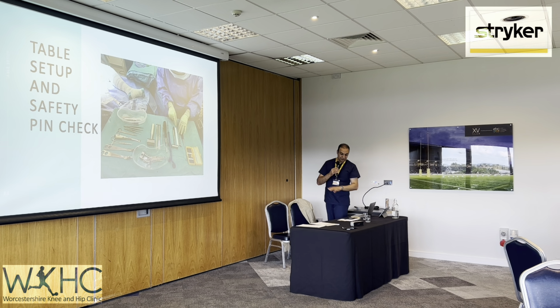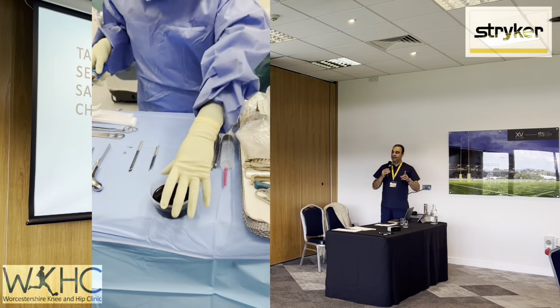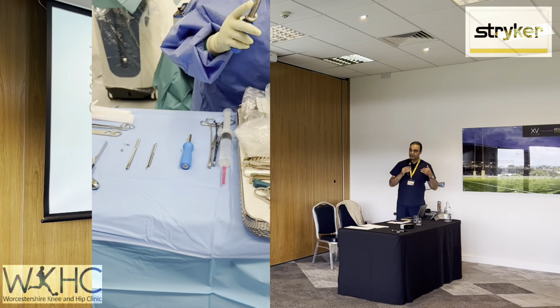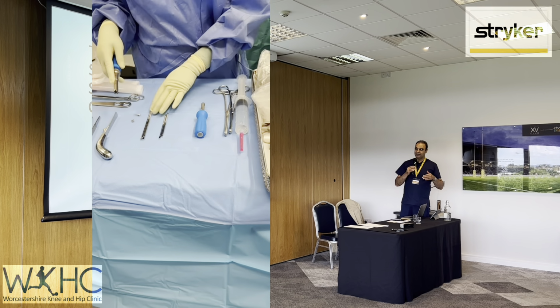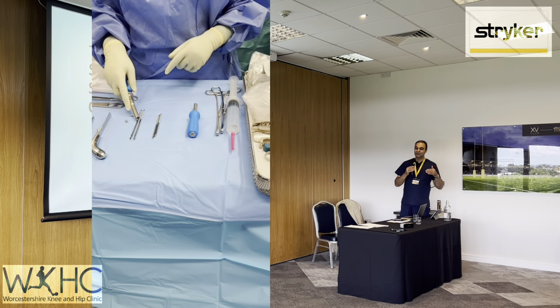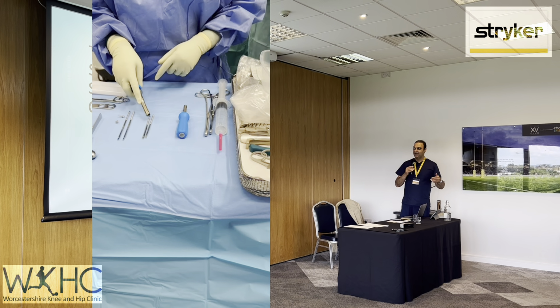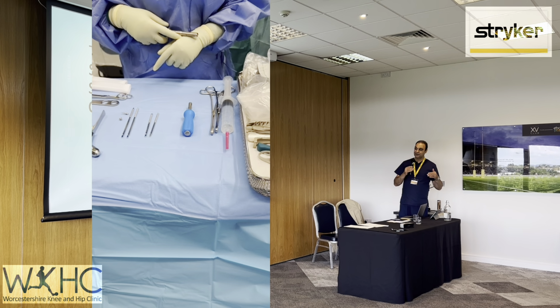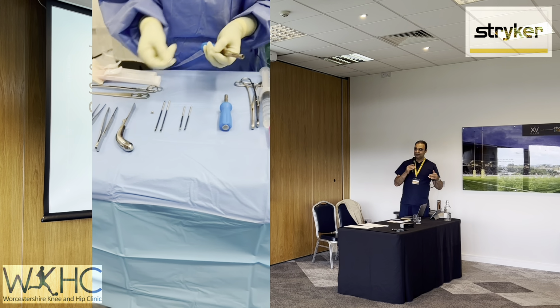At the bottom, there's a tray where we have the pins, the guides, and some checkpoints, and we're going to go through this on the stations. You have 2 long pins: there's 4mm pins, and there's 3.2mm pins. Now there has been a case where the 3.2mm pin has broken in the iliac crest. Not in our hospital, but there has been a case which has been reported. So we would recommend that you don't use those, use the 4mm pins.